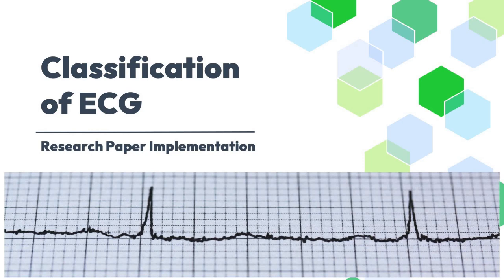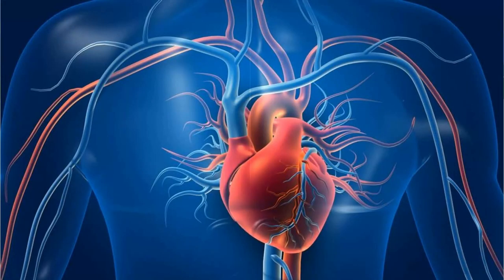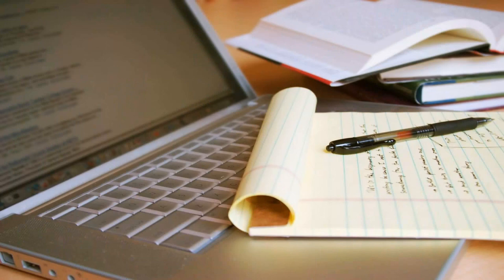Welcome. In this video, we will explore the intersection of medical research and deep learning. Today, we will be showcasing how we at Codersarts have successfully replicated a critical research paper that focuses on classifying ECG signals into 4 distinct categories. This is not just an academic exercise, it's a step forward in improving healthcare through technology. So let's start with the problem statement.